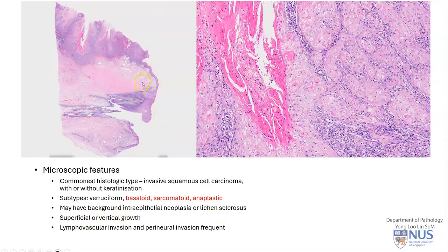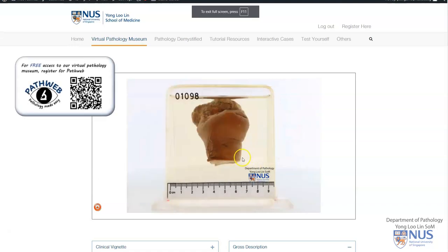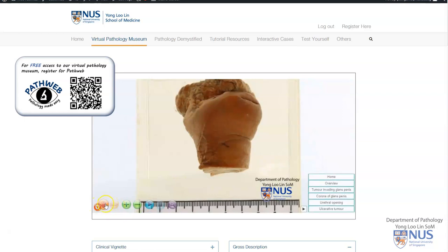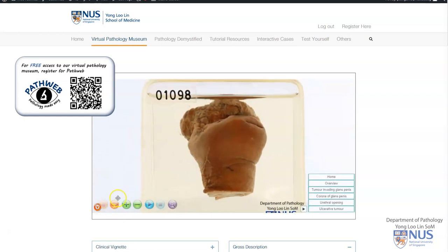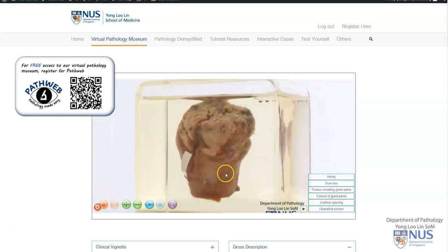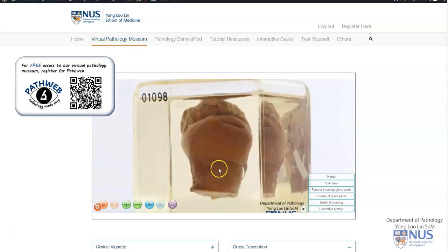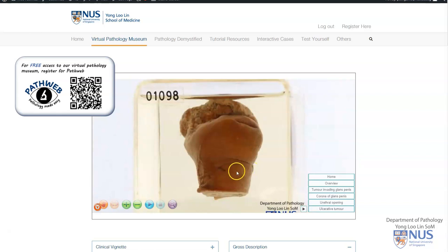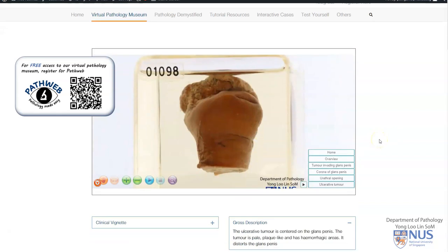These tumors can have a more superficial growth pattern or a vertical growth pattern where the tumor is more deeply invasive. Lymphovascular invasion and perineural invasion are frequent. Here is the page in PathWeb of the gross virtual pathology specimen of squamous cell carcinoma of the glans, and there is a separate video describing this specimen, which you can find in this video channel as well as in PathWeb.